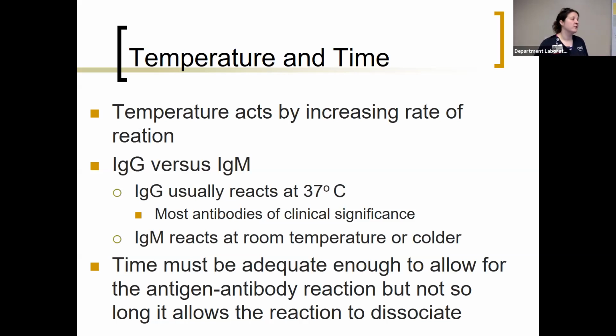Blood bank is so loud. I don't know if you realize how loud blood bank is going to be. You're going to have refrigerators, you're going to have freezers, you're going to have centrifuges. If you're automated, you're going to have instruments going, timers going off nonstop, centrifuges. It's very loud. Sometimes the timer would go off and I wouldn't even hear it. I was just in my own little world, I guess. So yeah. Usually my coworkers would say, your timer's going off.